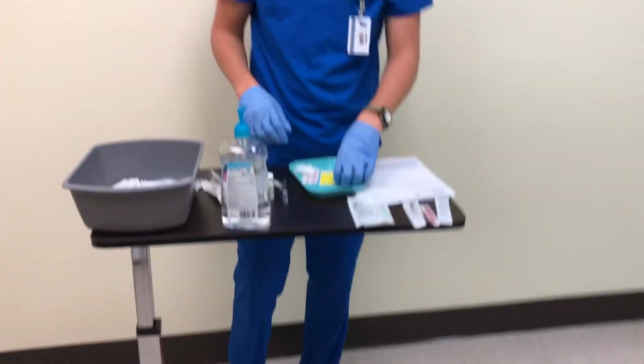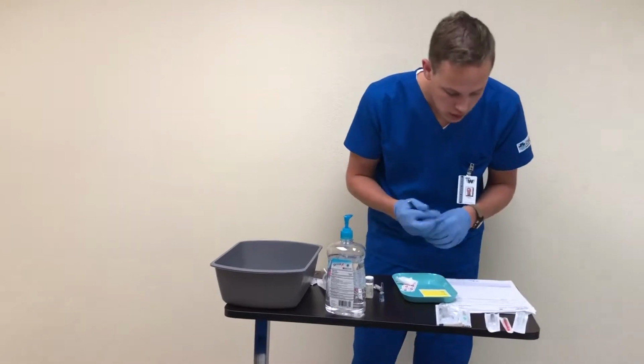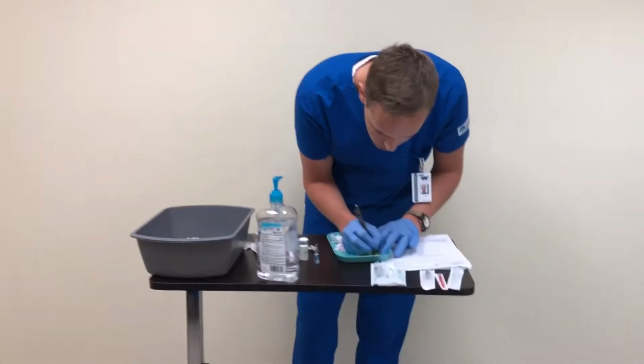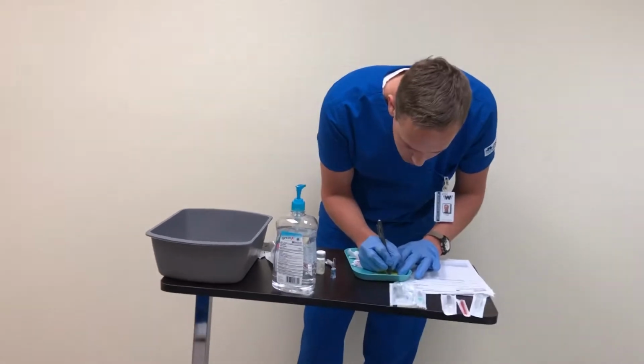And then I'm gonna have to label it so that I know which of the medications this is. So this is my PPD for tuberculin, and it is 0.1 mil.